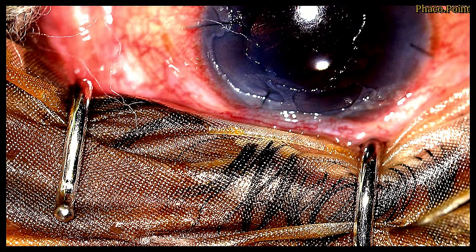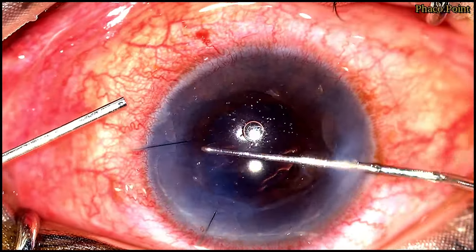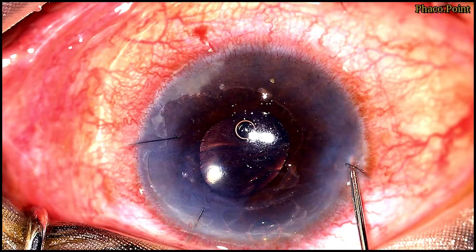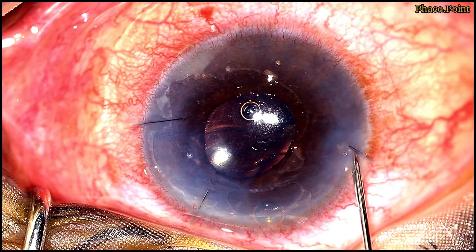These venting incisions are already present from the previous air injection. There seems to be a slight irregularity in the pupil, so with the help of a Sinski hook, with care and caution, and since I am going to have air completely filling the anterior chamber, I inject a little moxifloxacin prior to the air injection.